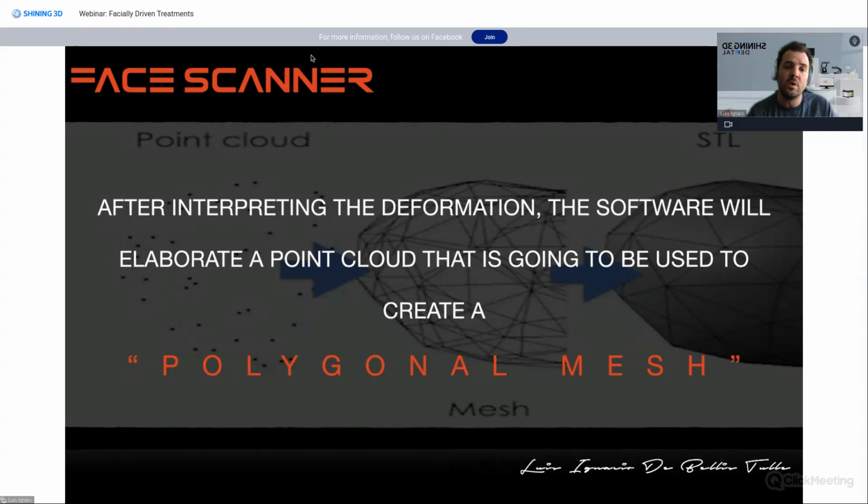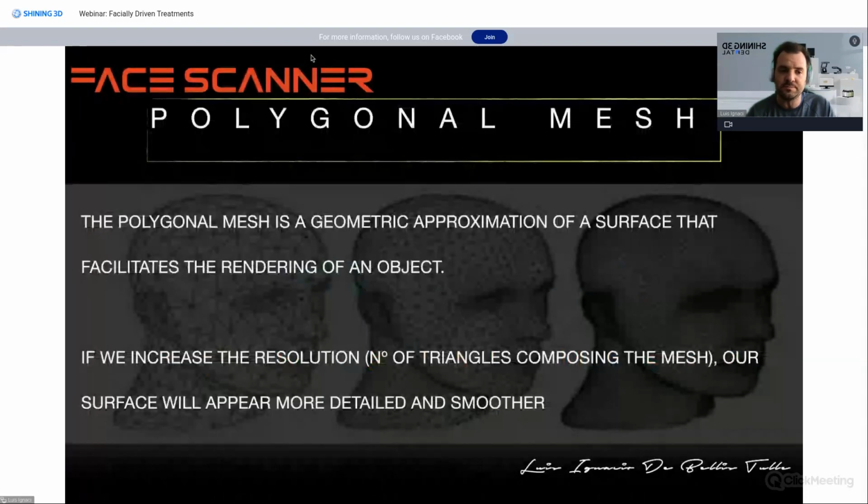That is what we will see as final users, and that's the rendering of our object. And what I'm telling you is extremely important, because with different protocols that I'm going to show you, it's going to be about photogrammetry and facial scanning with a facial scanner.